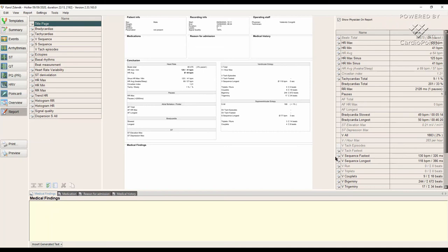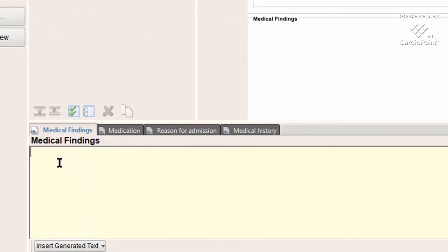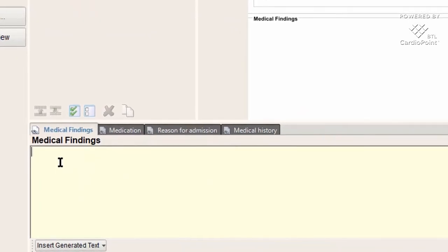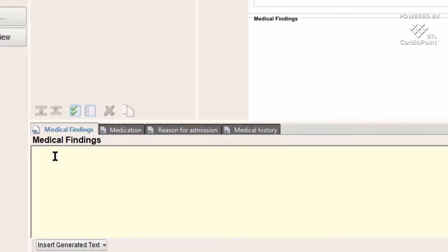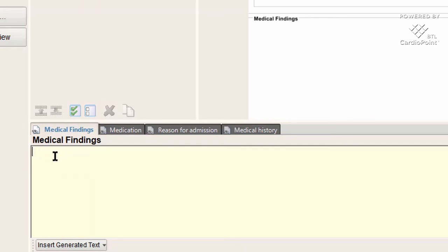In the text box Medical Findings, you can write a conclusion for your research. We can find a really helpful tool here, it's called Default Conclusion.